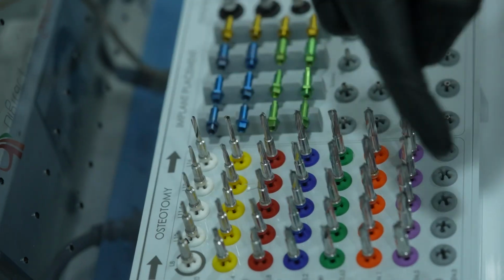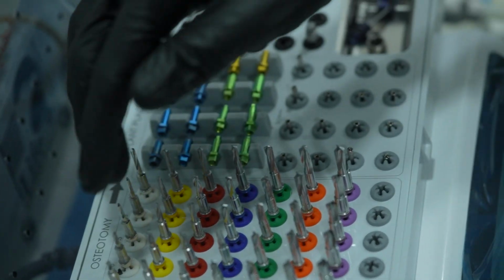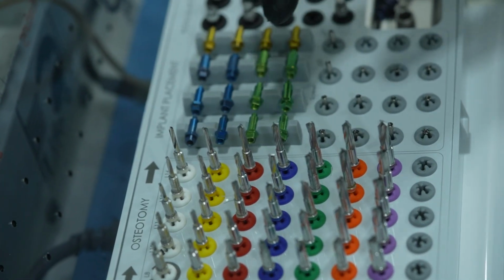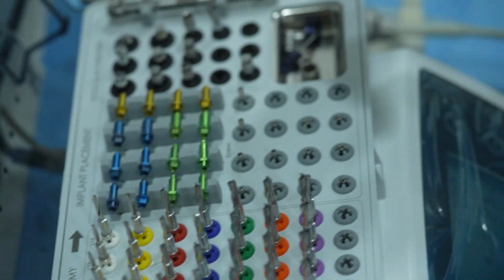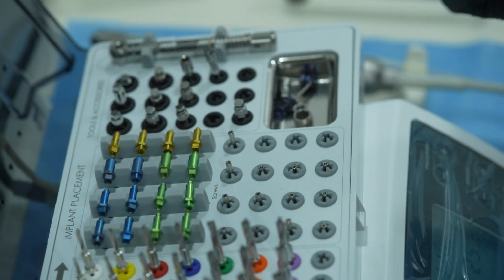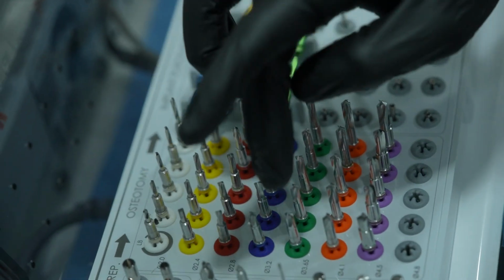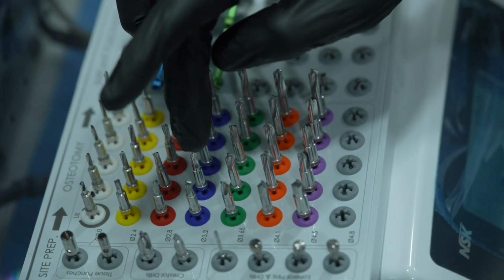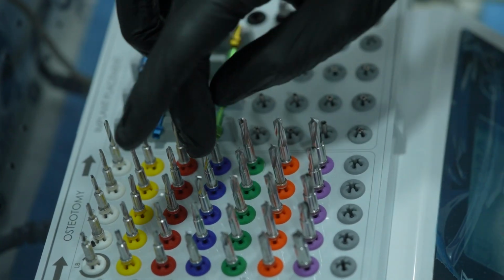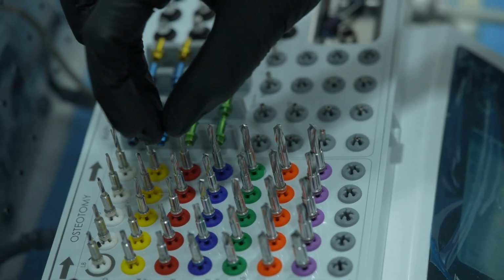You will see that there are more drills than the required surgical kits. Why? Because each diameter has a length specific drill. We are supposed to place an implant of 3.3 by 13. There is limited ridge, so we will use 3.3 by 13. Ideally we are supposed to use up to here, but since it is an active system, I will use one diameter less.